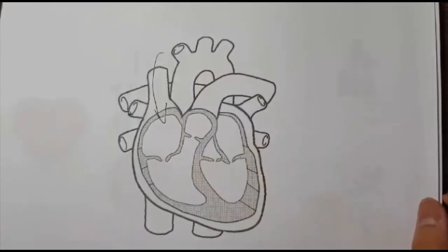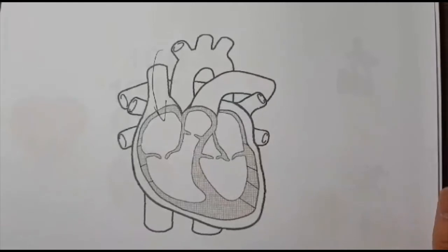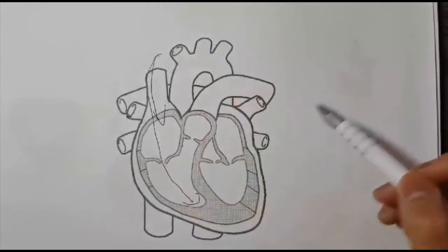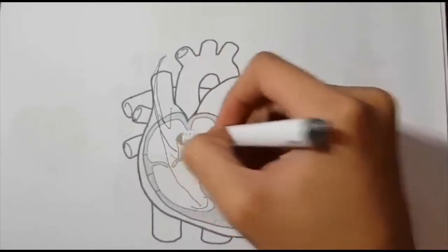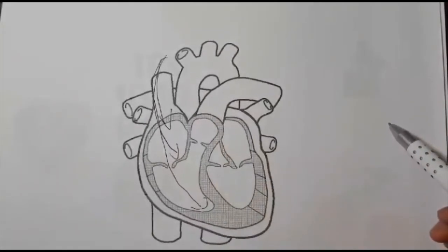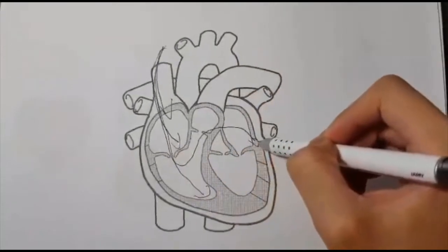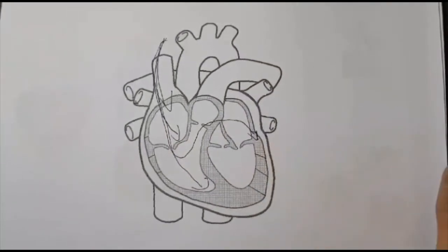Now there are three main types of pacemakers: single or double-chambered and biventricular. A single-chambered pacemaker has only one lead attached to the right ventricle to stimulate the heart. A double-chambered pacemaker consists of two leads, one in the right ventricle and one in the right atrium. This layout ensures these two chambers beat in sync and efficiently. Alternatively, the biventricular pacemaker has leads in the right atrium and both right and left ventricles.